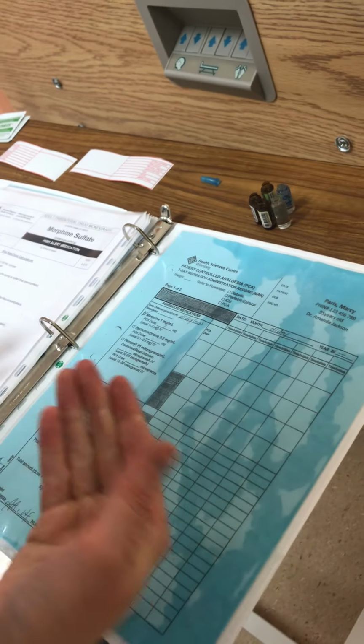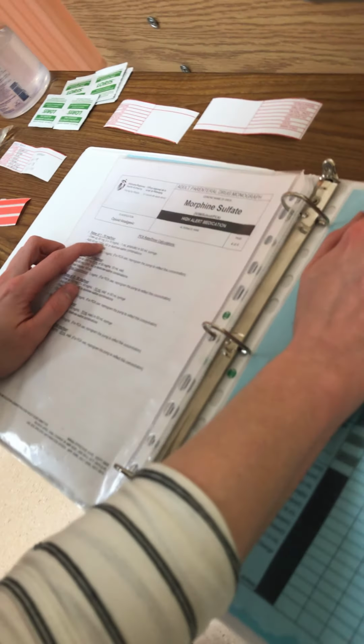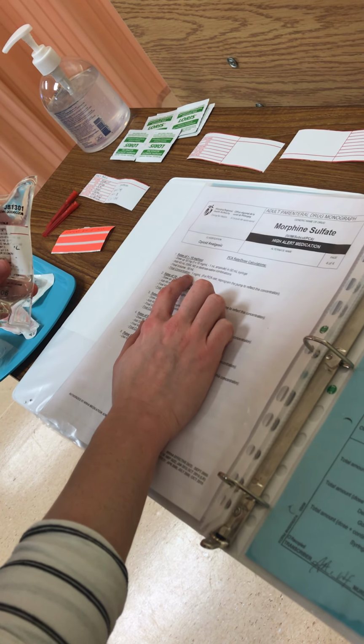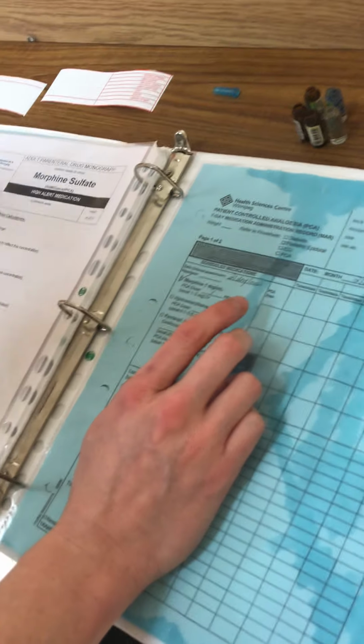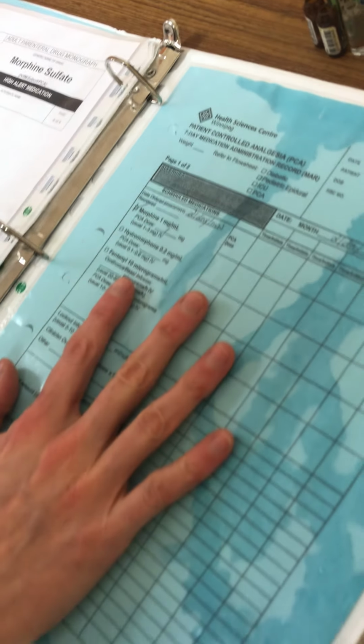My right dose: I'm going to be giving a dose of 1 milligram per milliliter, or per push of the button. I will be putting 50 milligrams into 45 milliliters for a volume of 50 mL, giving a final concentration of 1 milligram per milliliter. They will be getting that dose. That's the right dose. The right route is IV, PCA IV. I know that this is compatible based on what I've read from the parenteral drug monograph, and I know it's going to be an IV medication because it is on the PCA MAR, and the right time is now. So I feel confident with this.